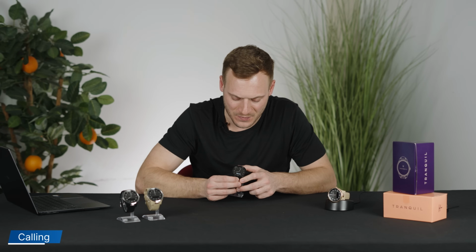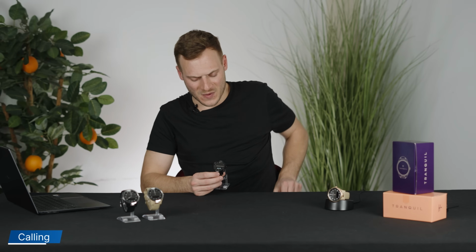They just press and hold it for about 2 seconds. Starting SOS call. It tells the wearer that it's starting a call and starts ringing immediately. My number is the first number, so it should start ringing any second. And as you can see, that call is now going to come through. There we go. And if I answer, you'll hear that it makes me press a number to prove I'm a human. So listen out for this.